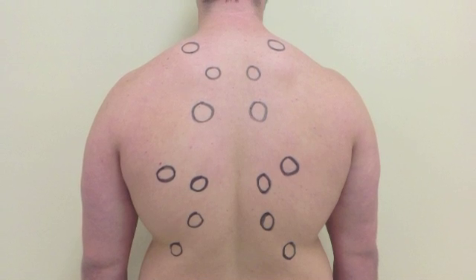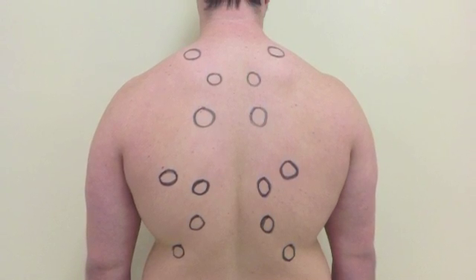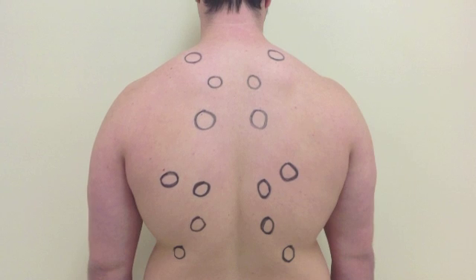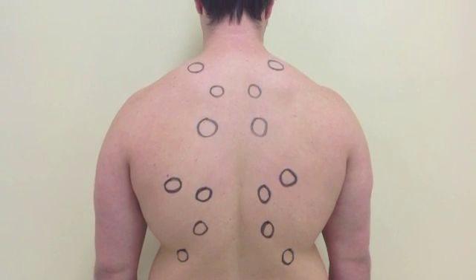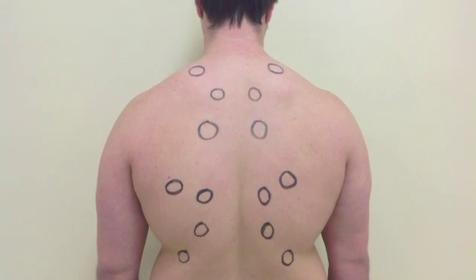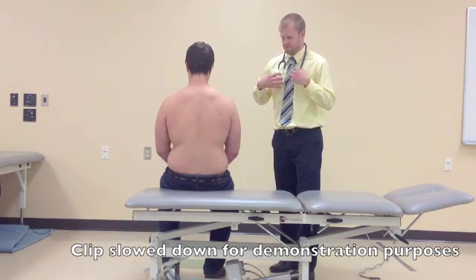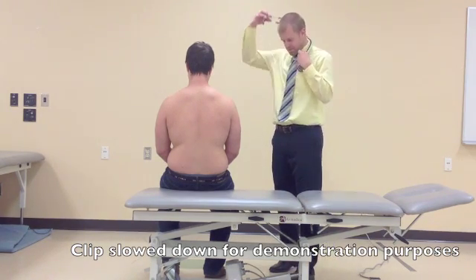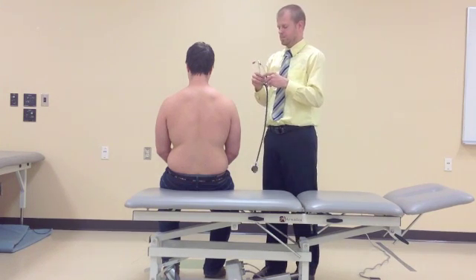This segment will go over auscultation of the posterior lungs. Appropriate places to auscultate on the back are identified in this picture. The clinician must listen to spaces between ribs and avoid auscultation over the scapula to hear breath sounds clearly. The patient should sit upright on the end of the plinth to allow access to the back for the clinician approaching on the right.